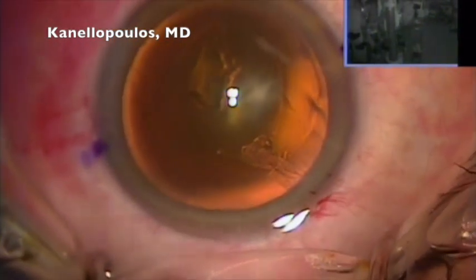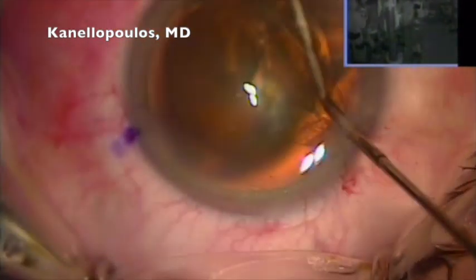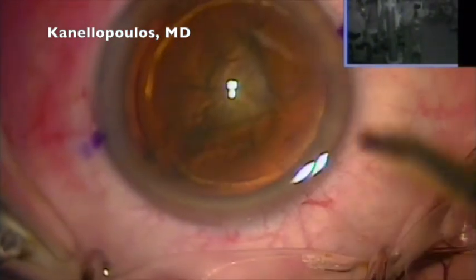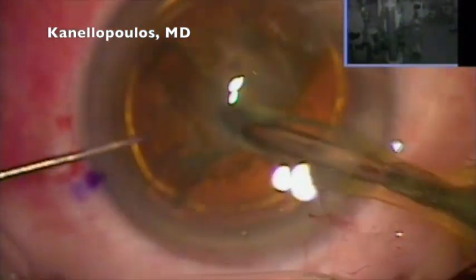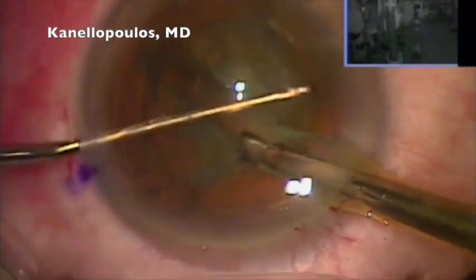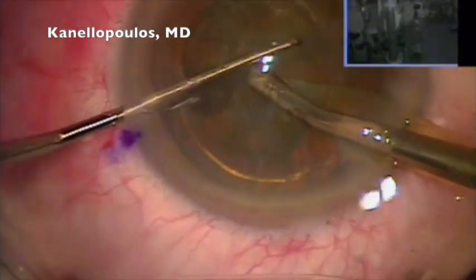I can still remember the first day I saw him do this as a resident at the State University of New York, Stony Brook, Nassau County Medical Center. Obviously, free up the lens with hydrodissection and go in. We're seeing that although young in age, this lady has a significant cataract.